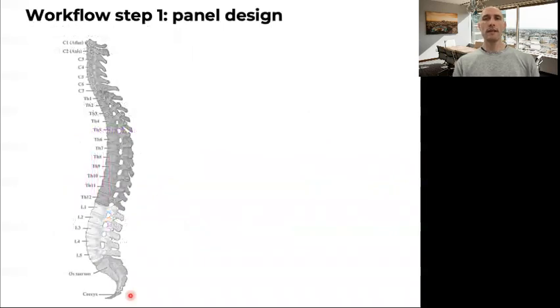So the first step of any experimental design, including Hyperion IMC, is panel design, meaning to design the panel, the antibodies that will be in your panel. So I think it's redundant to mention, but the markers in your panel will depend exclusively on your scientific questions. However, to make things easier, I recommend to always start from a proven foundation instead of starting from scratch. And the foundation I'm talking about is this backbone.